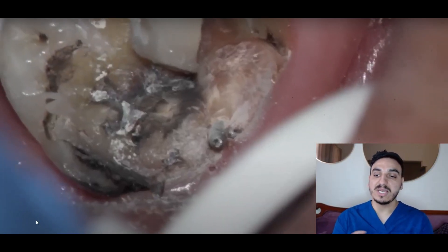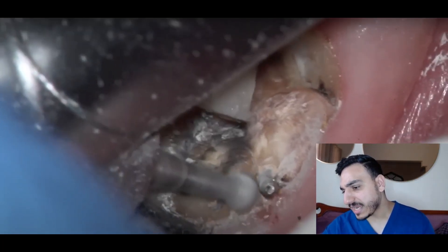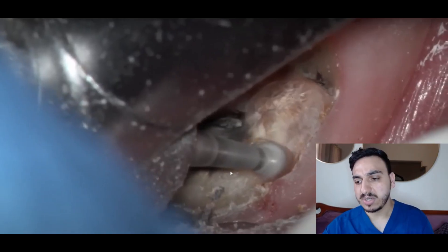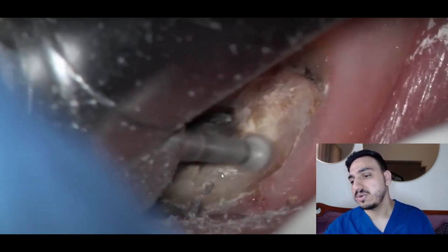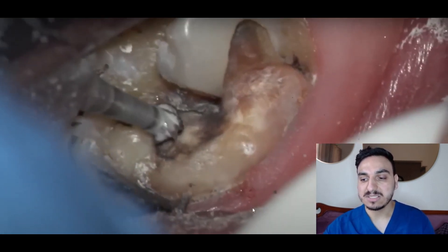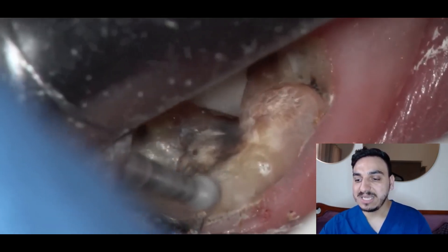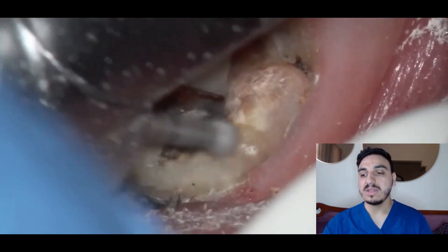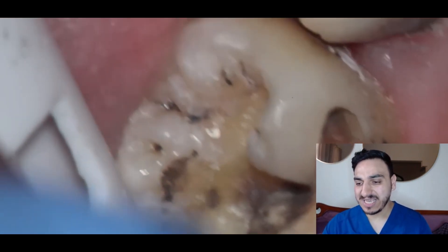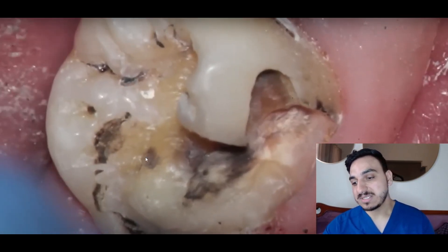The complication is from an isolation perspective — meaning isolating the tooth from moisture and other things. The operator is retracting with the mirror and using a burr to start drilling on that tooth. As I said, it's very near the gum line and there already looks like a small amount of bleeding. The operator continues to try to clean that cavity from all the decay and rot, and you can see it is a very large cavity.